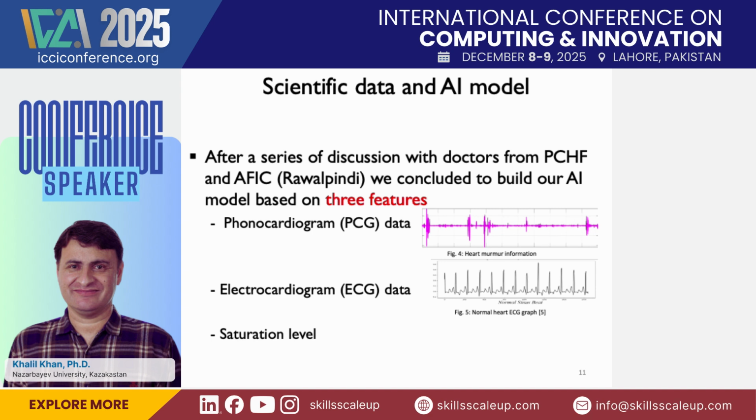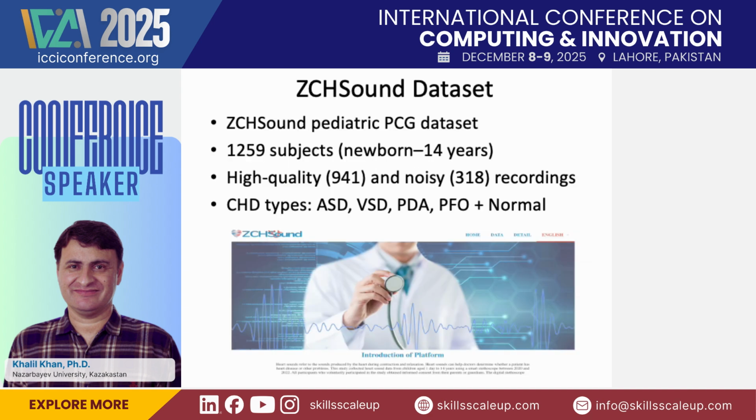So our database building is still in process, and we collected some data, but the data is not that much. I mean, we cannot train a classifier on that. Fortunately, last year a heart sound data set was released from one of the hospitals in China. So we contacted them and they provided us the data set. But in this data set, we have only the PCG recording, not the ECG or saturation level.